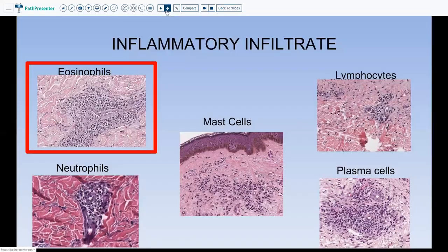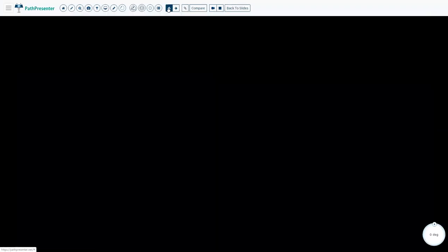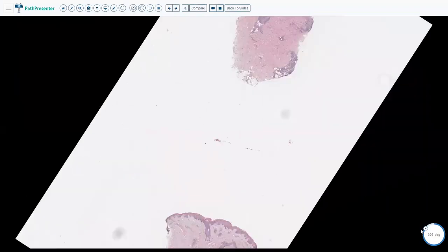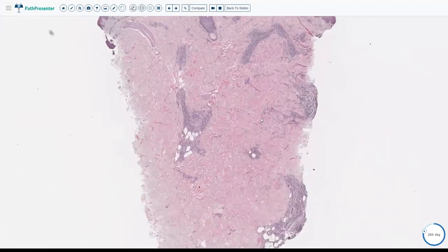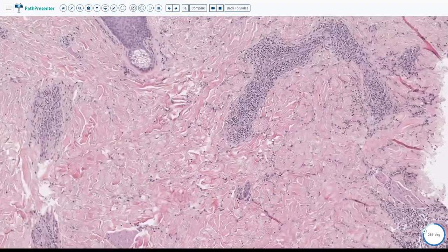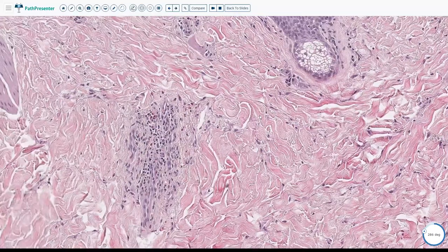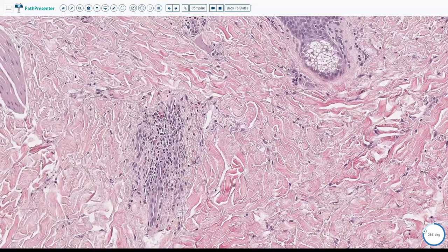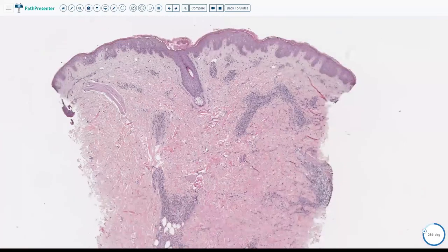Let's start with perivascular dermatitis with eosinophils. Here is a case: a 54-year-old female who presents with a pruritic morbidiform rash for 5 days. On punch biopsy, at low power we see perivascular inflammation in the dermis, superficial and deep. Going high power, there are predominantly lymphocytes, but scanning at high power you also see a lot of admixed eosinophils — visible as orange granules. So the diagnosis is perivascular dermatitis with eosinophils.